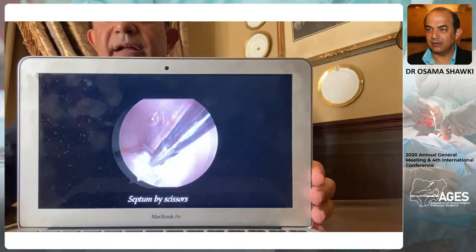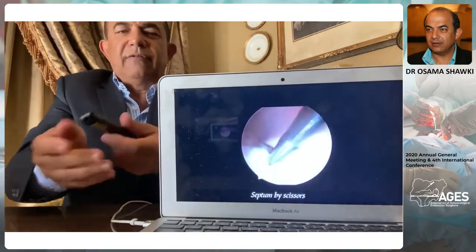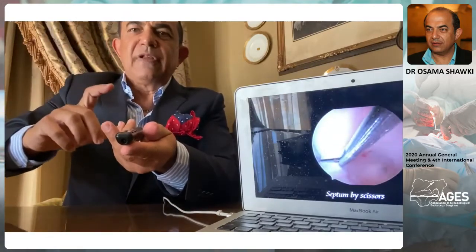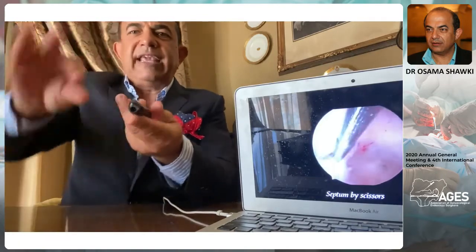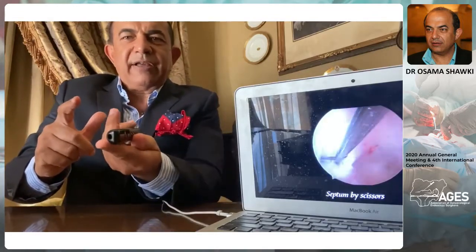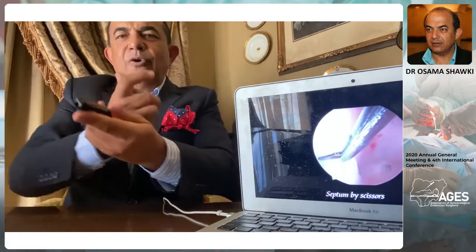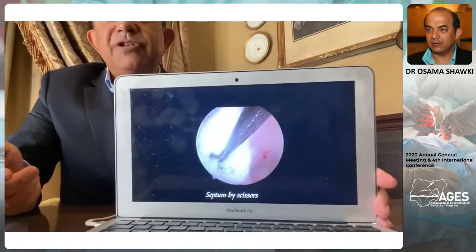You keep cutting, and rotate. I will show it to you, okay? If this is the telescope, nice. I have a good idea to teach you now, all right? So, this is the hysteroscope. You hold the hysteroscope camera in your hand, and the other hand is holding the scissor. If you want to look at the left and right, the classic teaching that everybody tells you is to hold the light cable and rotate the light cable. But how can you do this when you have a hand holding the scissors? So you rotate the whole camera like this. When you rotate the camera like this, you can check the cornua or the lateral wall, and the scissor in the other hand. So it's a combined rotation of both left and right hand to access the septum on both sides until the procedure is finished.